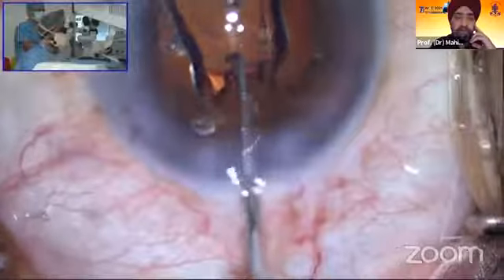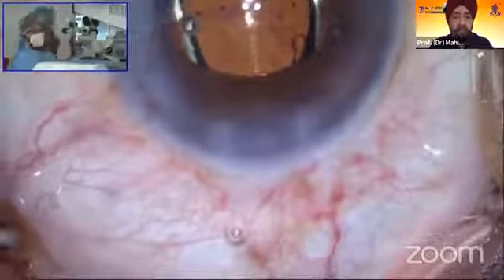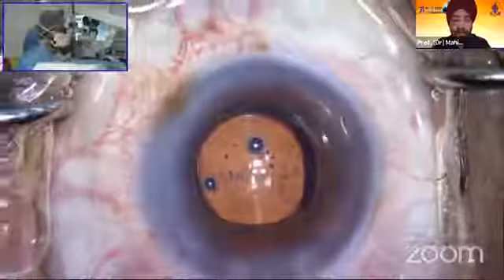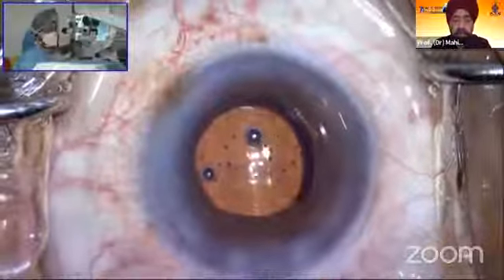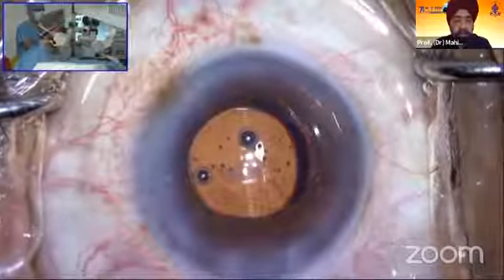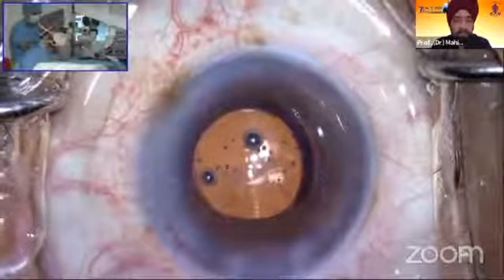You can see it is going in very smoothly and gently — it does not open with a jerk and does not take ages to open either. The material is time-tested. We have used it in our patients including VIP patients, and you can see it sits very well into the bag. The Synergy lens has very minimal issues. In close to 50 eyes that I have done, there isn't any significant complaint of dysphotopsia.